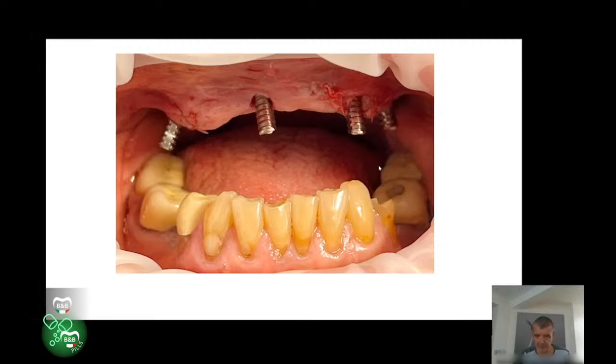And it was all done transmucosally. I did have to make small openings in the tissue here in order to seat the MUAs because of the width of the crestal bone adjacent to it, and I was actually very curious to see. When I made this small incision to seat the MUA, I was able to have a sneak peek at the labial plated bone around this implant and was very pleased to see it was totally intact.